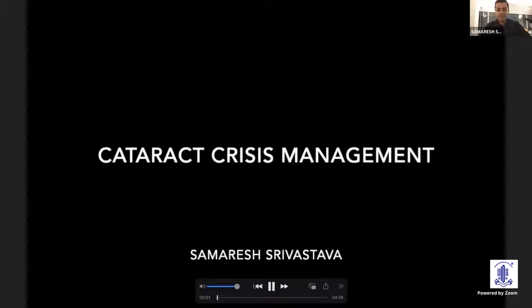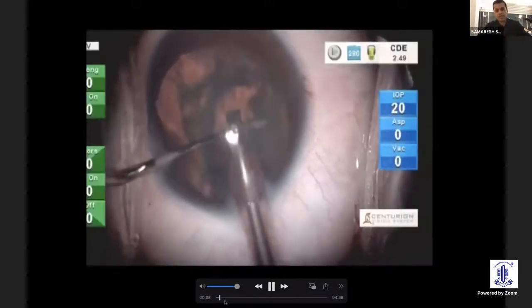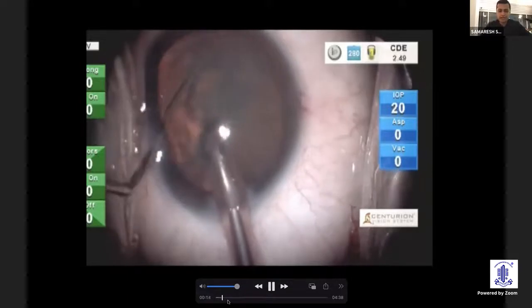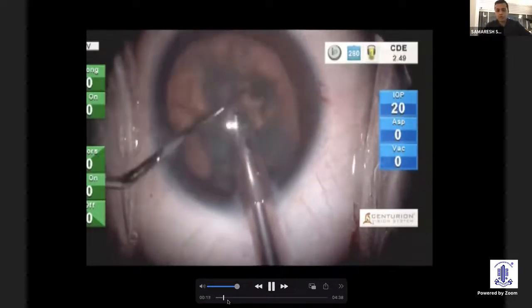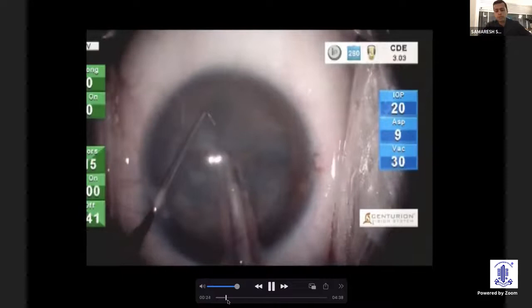So I'm going to discuss a case. This is quite similar to the first case that we discussed today by Dr. Subhash Prasad. I have a patient with a toric IOL. Now, these are one of those cataracts which are neither here nor there cataracts. They're not very dense, and at the same time, they're not very soft. So you're not sure whether you want to chop or do a 4-quadrant. So I did a chop maneuver in this patient, but then I realized that the chop wasn't complete.